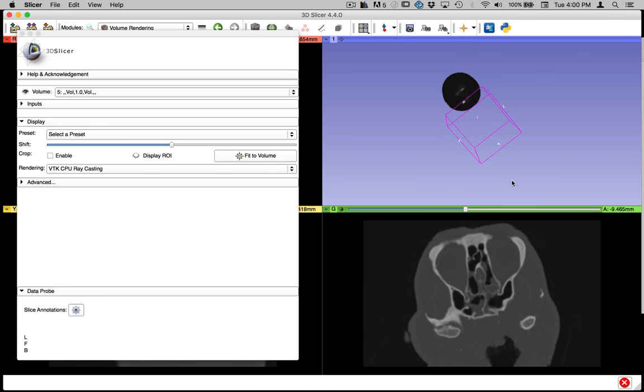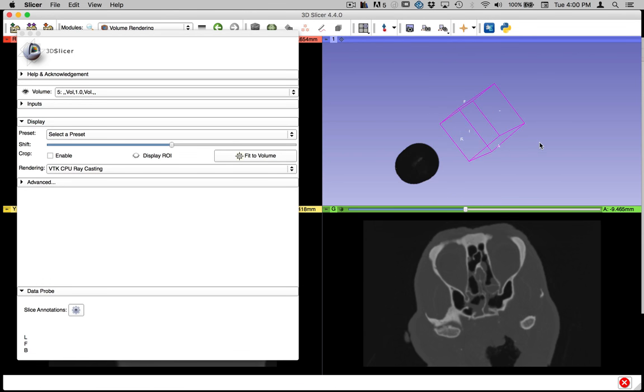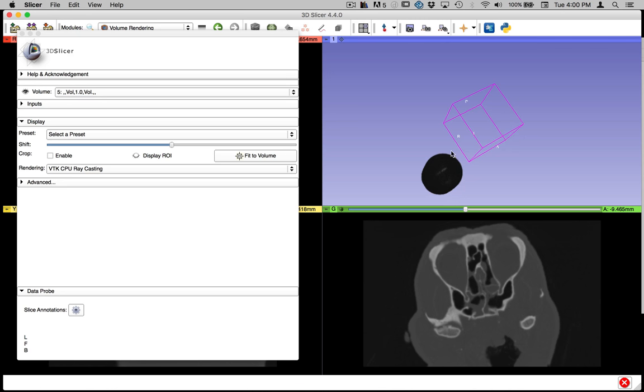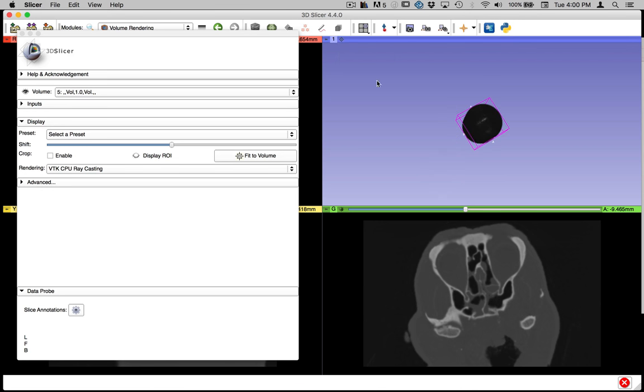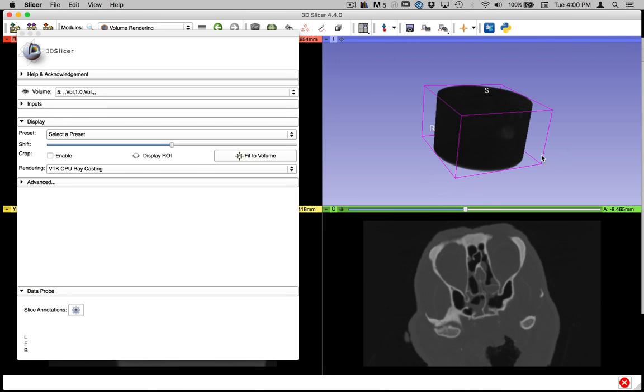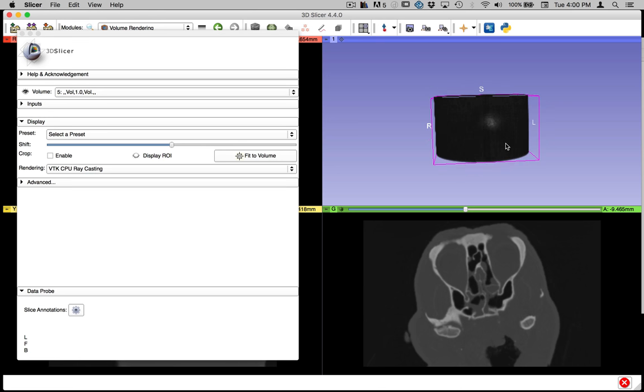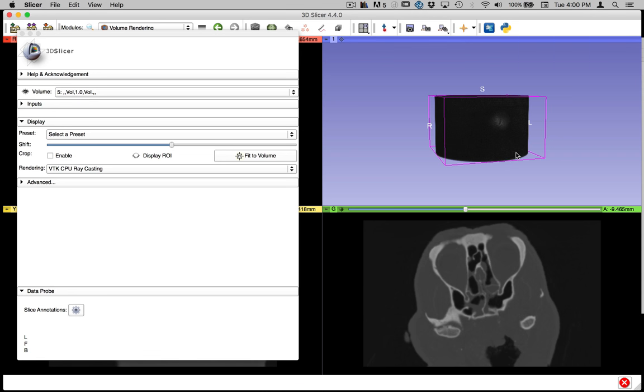And it's lagging, so it just popped in there. So now, there is my volume. If I want to center it in the world, there's this little button up here in the 3D view. It's called center the 3D view on the scene. So we click on that, and it goes into the middle.